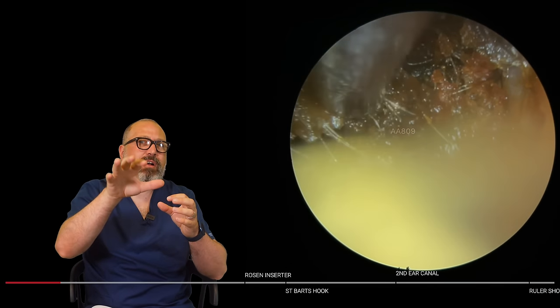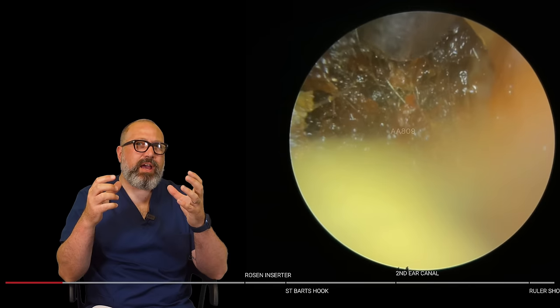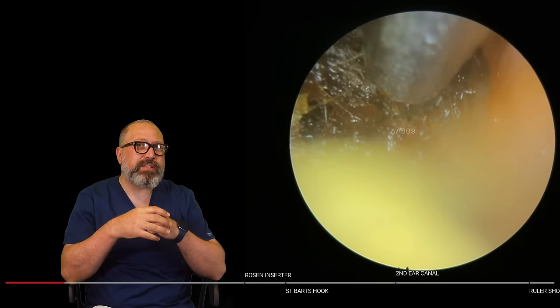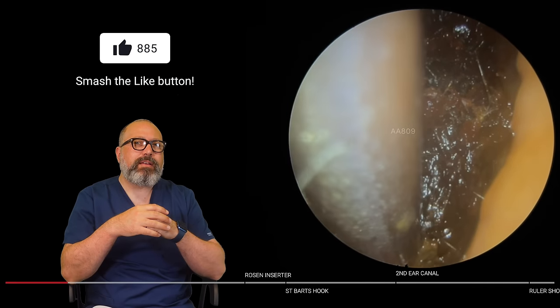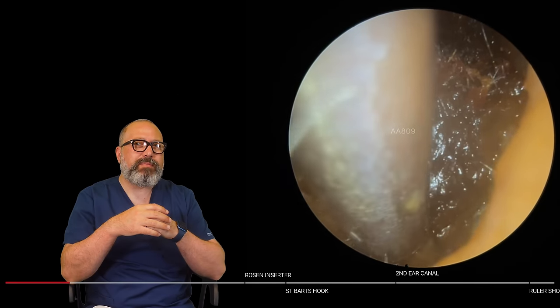But that larger, darker piece you can see at the back there, I'm thinking that is one solid block, but actually it's lots and lots of very dry pieces attached together. Just starting to come away. Yeah, giving that a little bit of a wiggle.